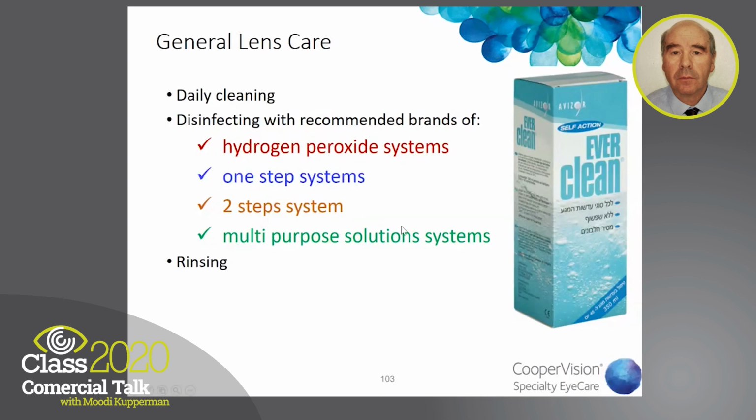Of course, no talking about contact lenses without daily cleaning, without general lens care. This is the Everclean, which is very good for scleral lenses, GP and soft, and for all soft lenses. We are using this system in our place, but in any other place you have your own systems. So when we talk about fitting of contact lenses, the fitting must include how to take care of the lenses.